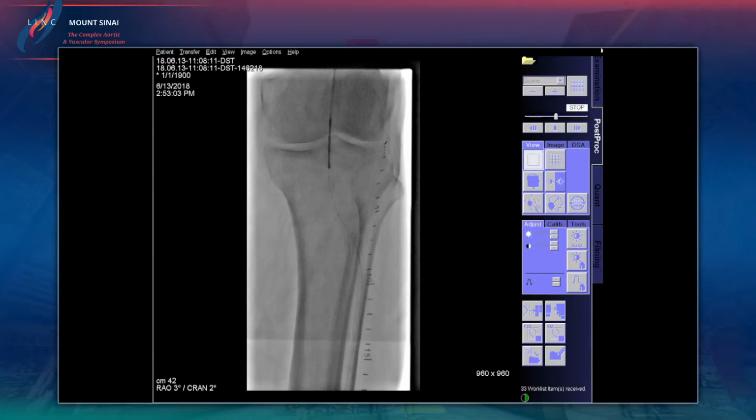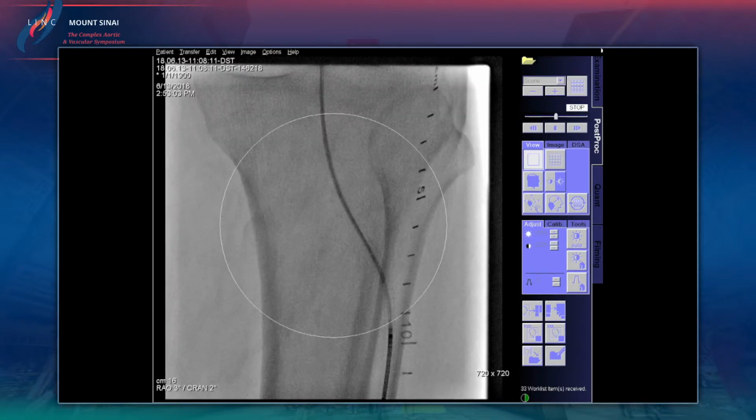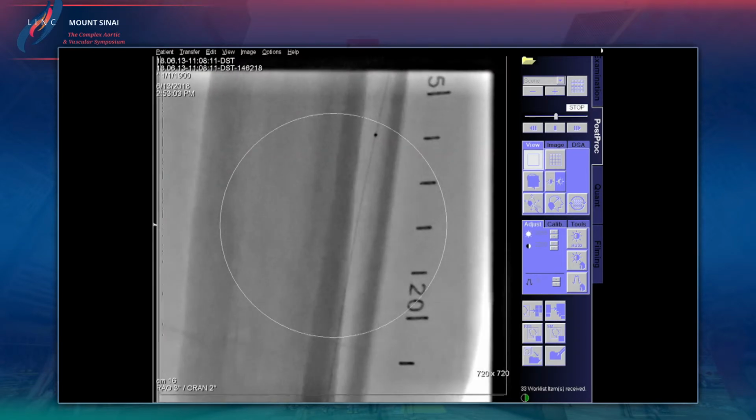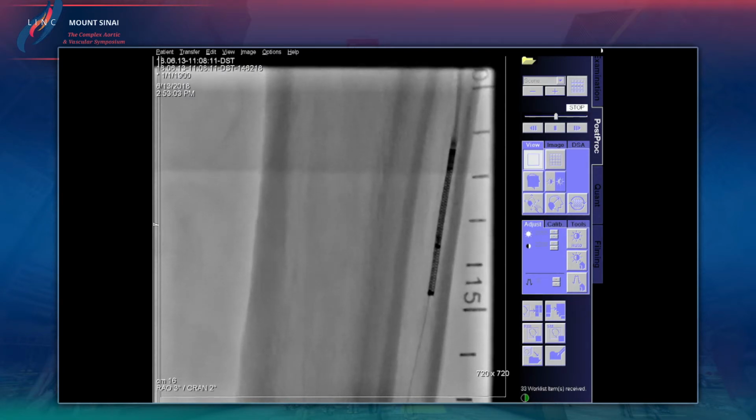So I'm going to do what Brian suggested. What we're going to do is a directional atherectomy of this. Can you show me going through the stent, guys? Thank you. One of the things here is you've got to be careful as you go through the stent, just to make sure that you don't have any issues. So we're just going to get down away. Show me above.